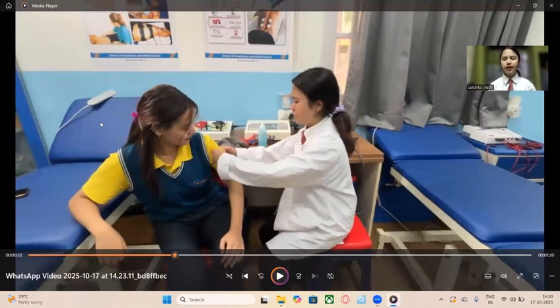After the introductory part, I switched on the ultrasound machine. Since the arm involves more superficial tissue, I'll select 3 MHz frequency, since 1 MHz frequency is for deeper tissue, like in chronic back pain. I am setting the machine to pulsed mode as this is suitable for acute conditions or inflammation. As I had mentioned earlier, pulsed mode is suitable only for acute conditions or inflammation. The intensity is set around 0.8 watt per square centimeter and the timer is adjusted to about 5 minutes.